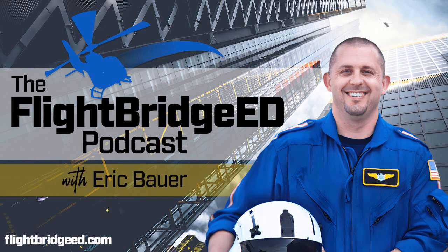Those are normal parameters. And so how do we glean information from that? We have an end-tidal CO2 at 22. It is low. Remember the 3 Ps of end-tidal CO2, and really I would focus on the perfusion status first, which we definitely have a lower blood pressure. MAP is 66 though, and so is that end-tidal CO2 an indication of a partially compensated metabolic acidosis? And I would probably most likely say that it is. It's either perfusion or that acid-base disorder.